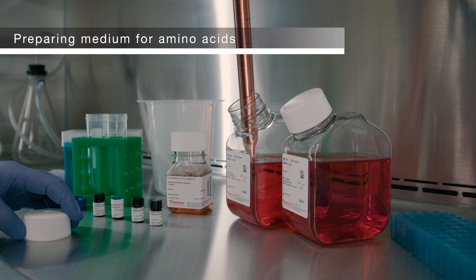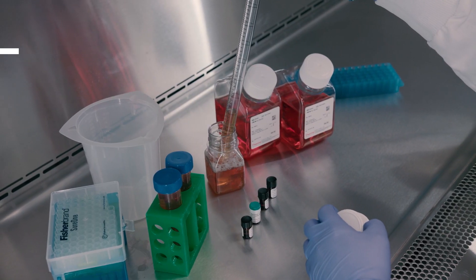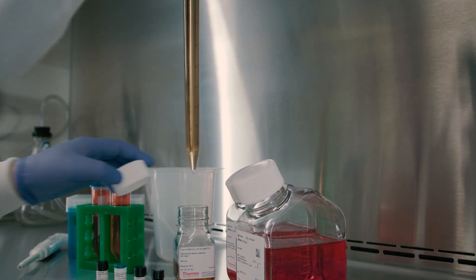The next step is to prepare the medium for the addition of the amino acids. Remove 50 milliliters of the SILAC medium from each bottle and replace it with 50 milliliters of thawed dialyzed FBS.